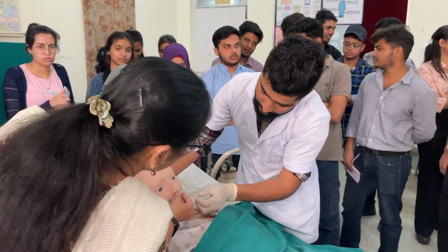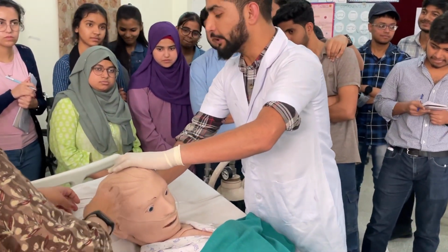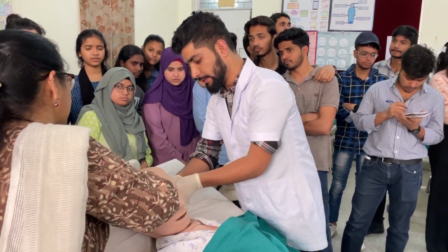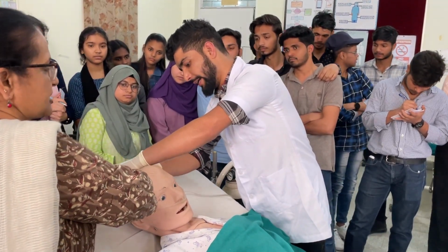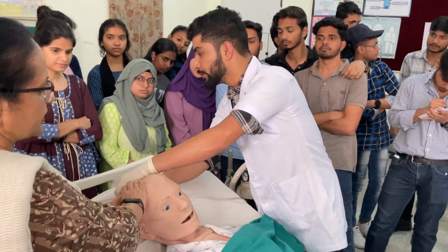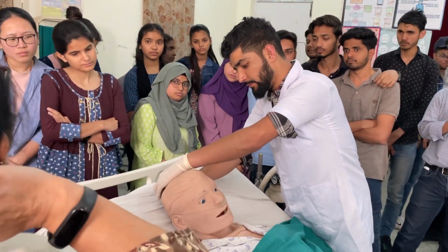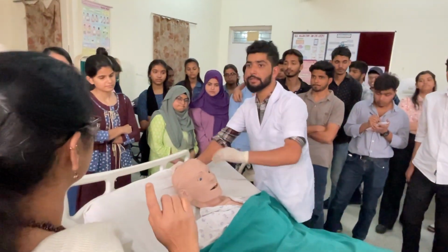It should be placed behind the ear, above the occiput, above the head. Otherwise, when the patient lies down, he will not be comfortable as it can hit, okay?